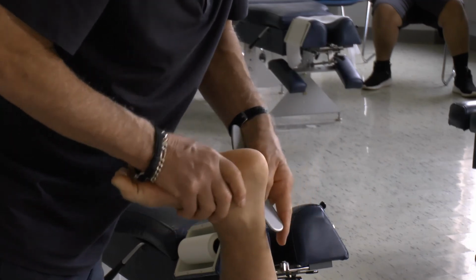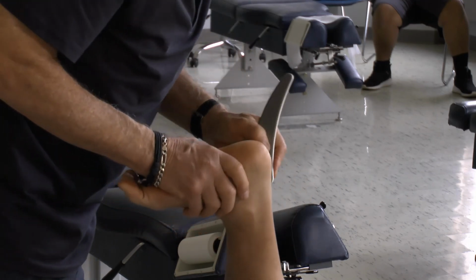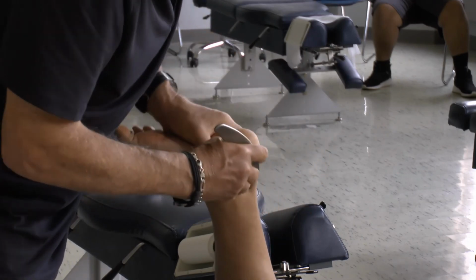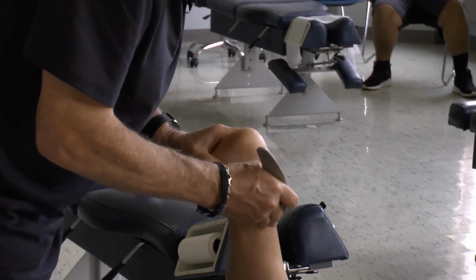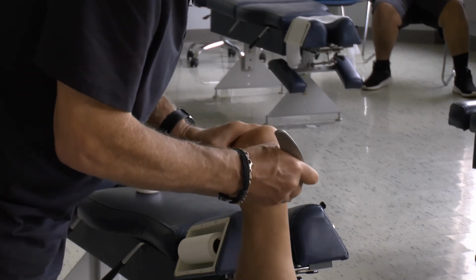And I'm going to work the Achilles tendon on the outside. The camera can't see this very well, but it'll see it better when I'm doing the inside. Working that Achilles tendon. This is improving dorsiflexion as I'm doing this. At least of the soleus because the knee's bent.